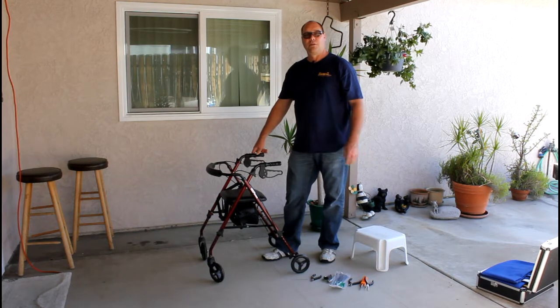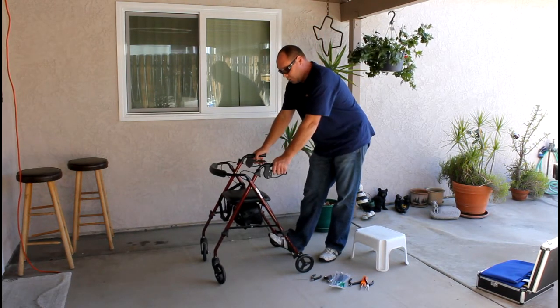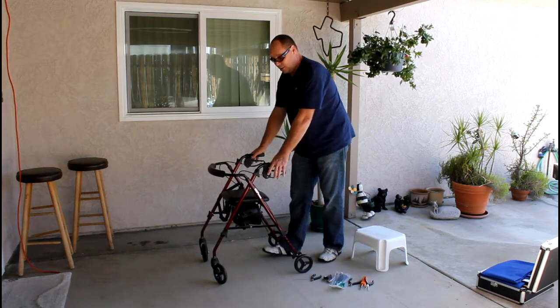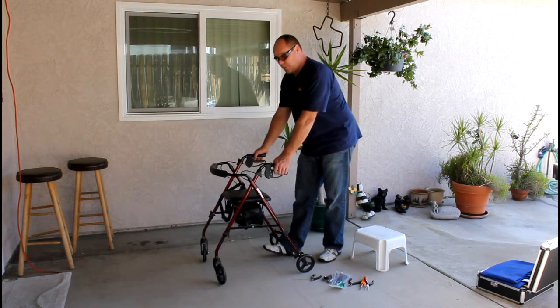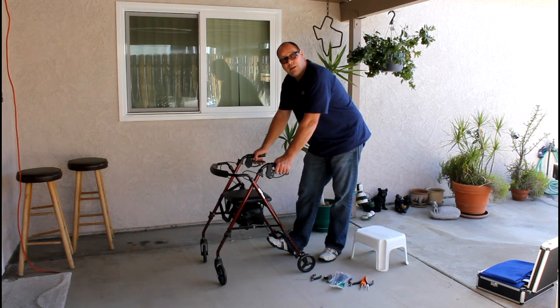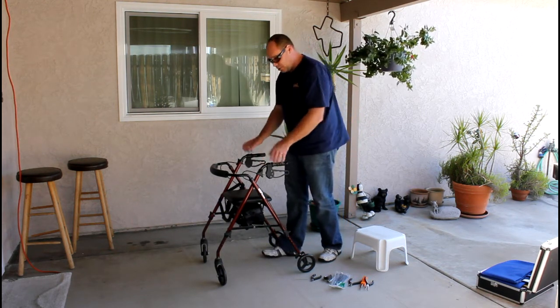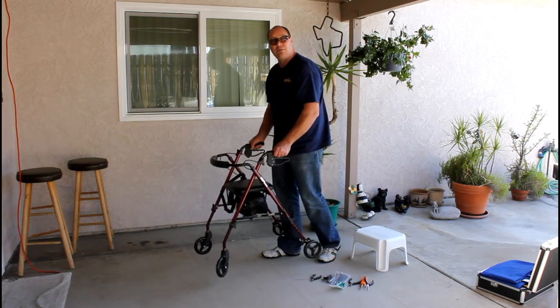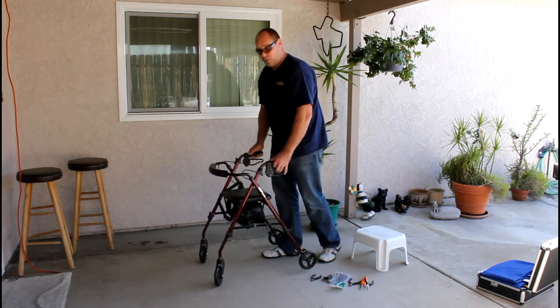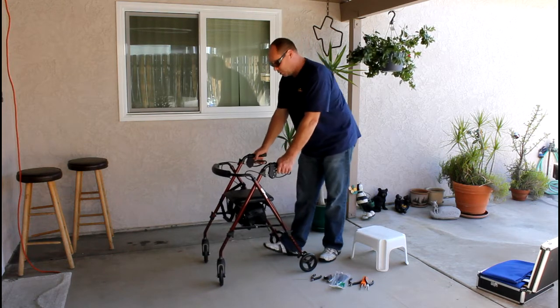Let's start with the first thing: the handbrakes — this is the most important thing. Statistics show about 25% of all falls are caused by a four-wheel walker, and some of the main reasons are because people trust that the brakes are actually working to slow them down or stop them. When they don't, this walker, which is about 10 to 20 pounds, becomes a counterweight and can tip over or throw them forward. It's very dangerous, so they need to have control of this.